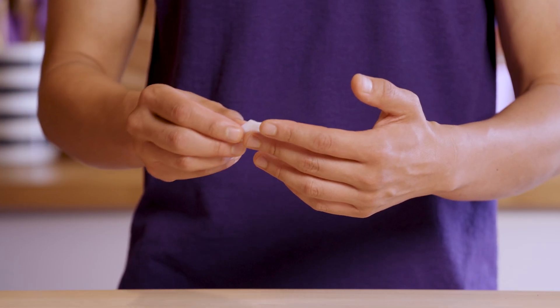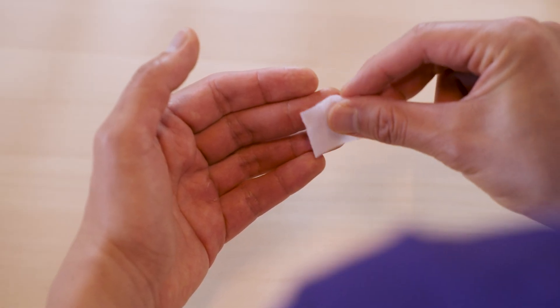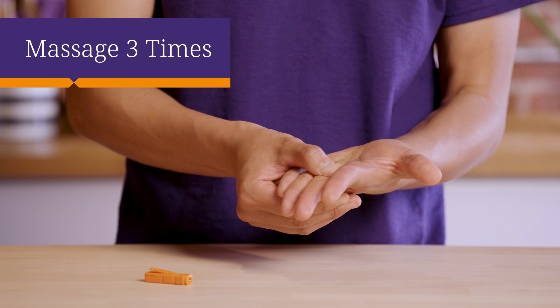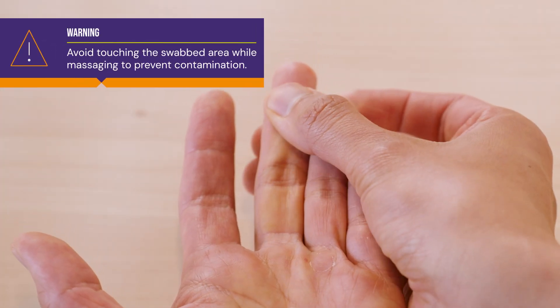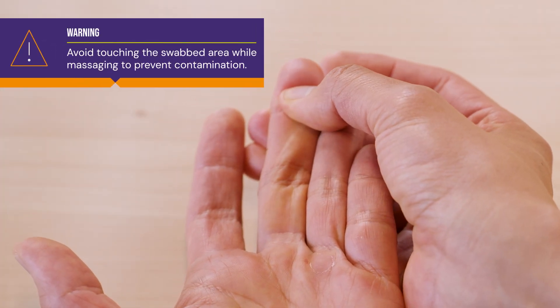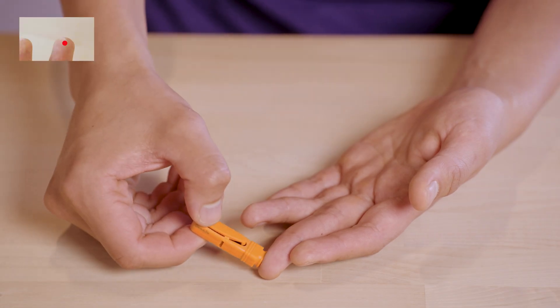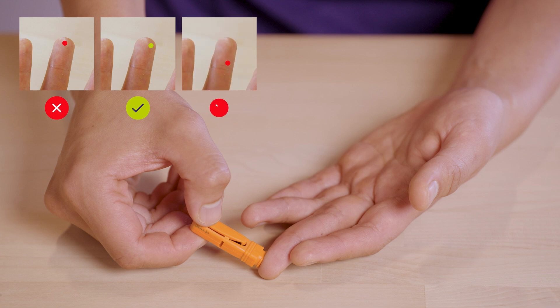Now sanitize the fingertip you will use for the blood sample by wiping it with the alcohol swab provided. Stand up and gently massage the palm of your hand, starting at the base and moving along the entire length of the finger up to the fingertip. Repeat this three times to help the blood flow. Place the lancet on the side of your fingertip, avoiding the center to reduce sensitivity. This will make the process more comfortable.